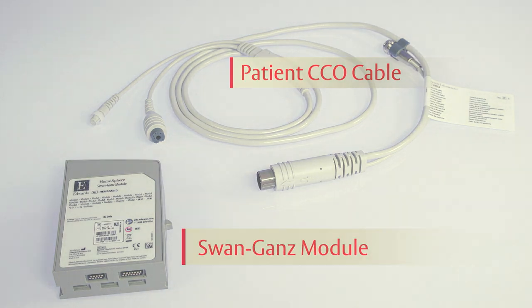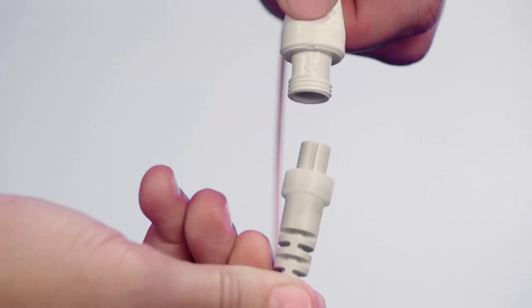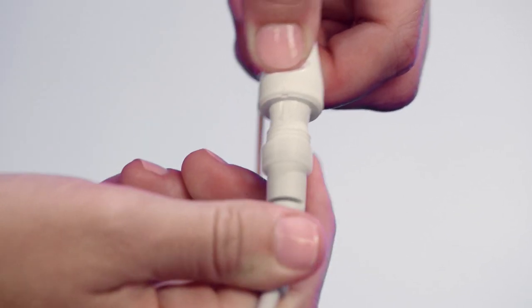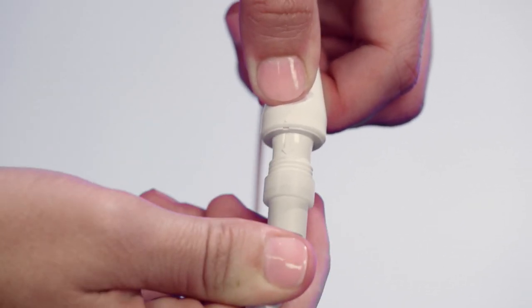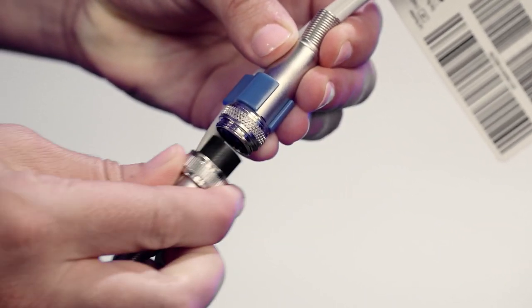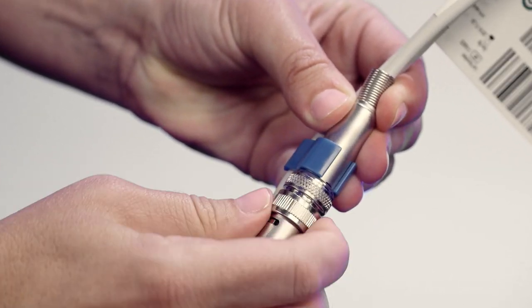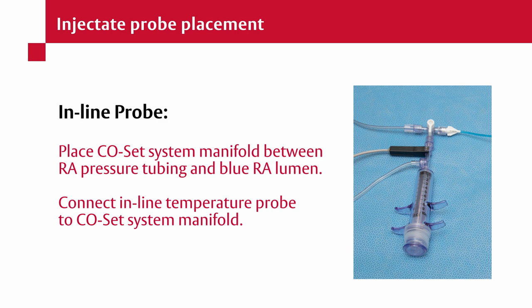Attach the catheter end of the patient CCO cable to the thermistor connector on the SWAN-GANZ ICO catheter. Connect the injectate temperature probe, inline or bath, to the silver connector of the patient CCO cable. If using an inline probe, connect the inline thermistor to a compatible pressure tubing manifold.